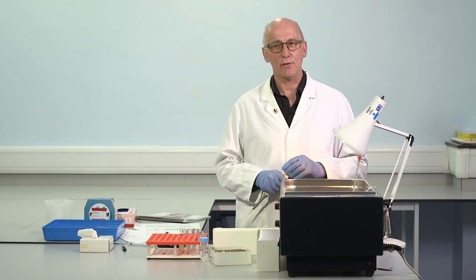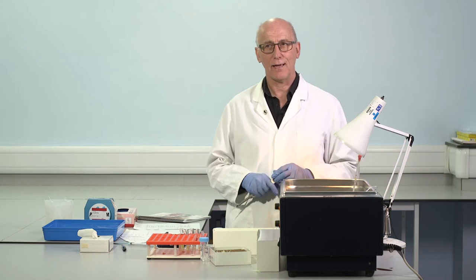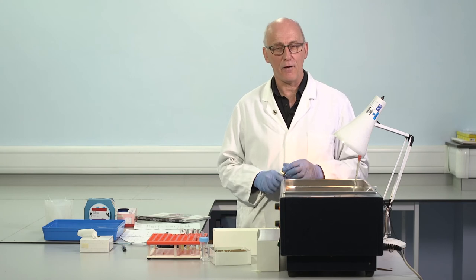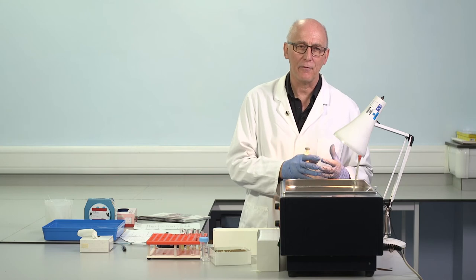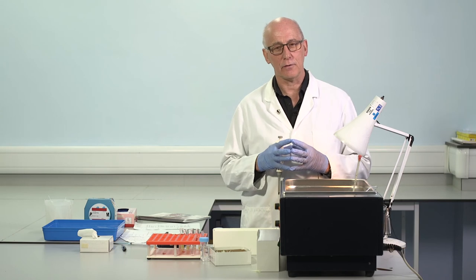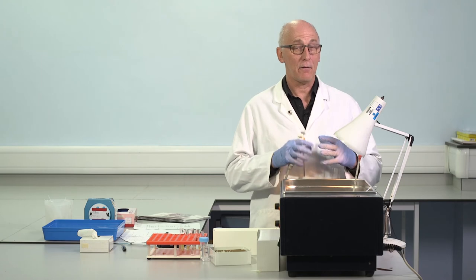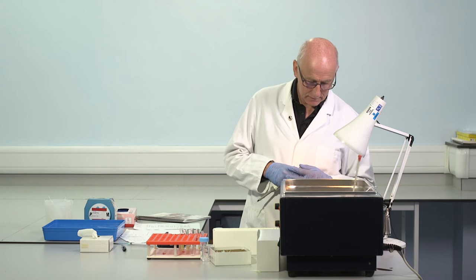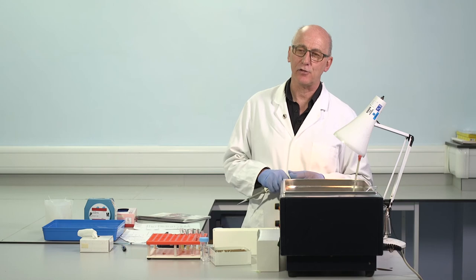Phospholipids in APTT reagents are made in a number of different ways. Sometimes they're extracted from tissues, that still occurs. Very frequently they're highly purified, and for many reagents these days they're not just highly purified but are synthetically manufactured and carefully controlled so that the phospholipids present in the reagent are very specific. But they're quite different between different reagents, and one of the reasons for this is historical and is about the lack of standardization in the past.